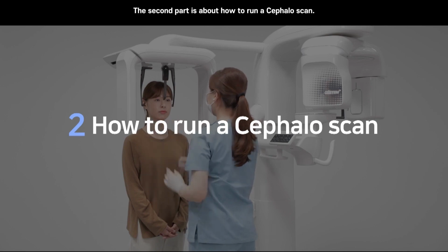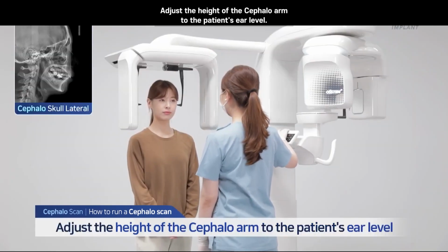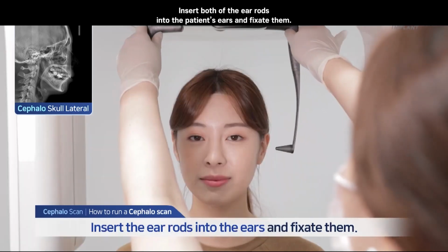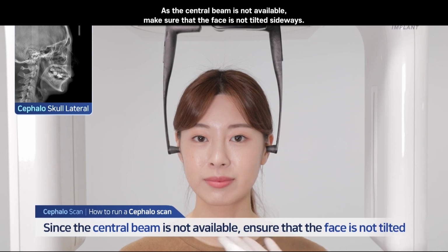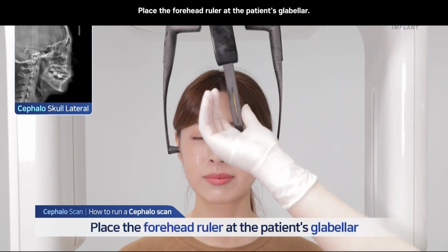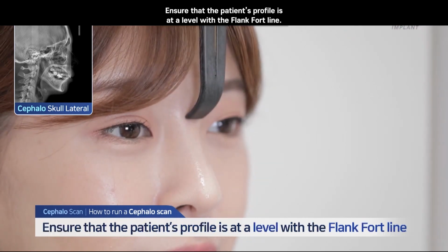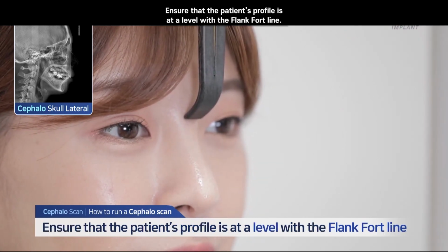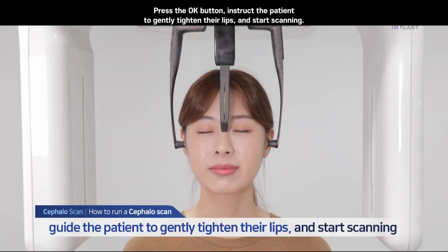The second part is about how to run a cephalo scan. Let's take a look at the cephalo skull lateral scanning position. Adjust the height of the cephalo arm to the patient's ear level. Insert both of the ear rods into the patient's ears and fixate them. As the central beam is not available, make sure that the face is not tilted sideways. Place the forehead ruler at the patient's glabella. Ensure that the patient's profile is at a level with the Frankfort line. You can control it by raising or lowering the head. Press the OK button. Instruct the patient to gently tighten their lips and start scanning.